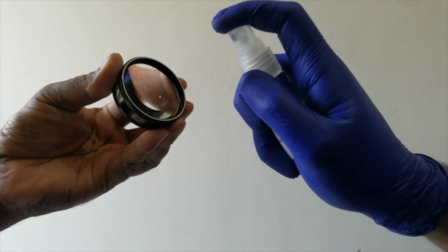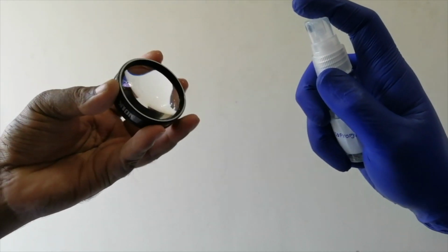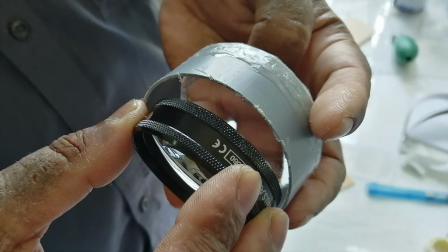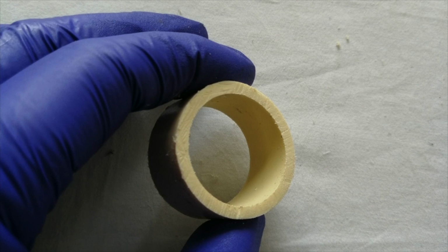Clean the 20D lens with isopropyl alcohol and a dry tissue paper. Then insert the lens into the cut pipe, keeping in mind that the surface which has to be towards the patient is near the front plastic cover on the pipe. The modified 20D lens is ready to use.